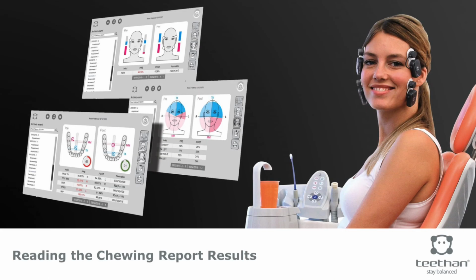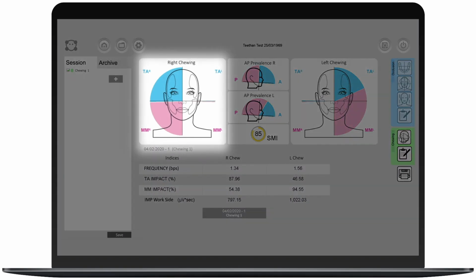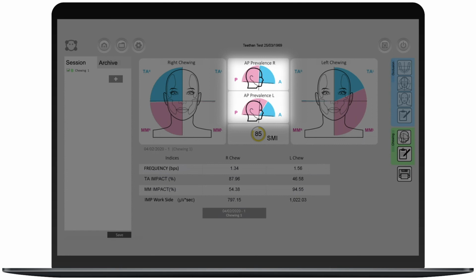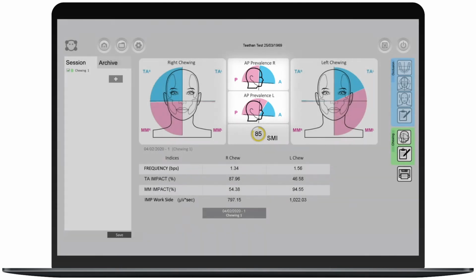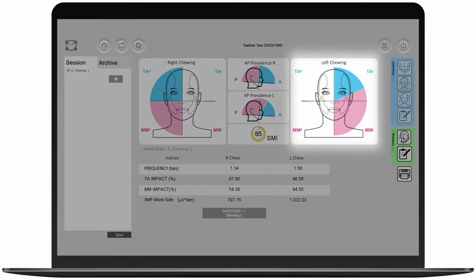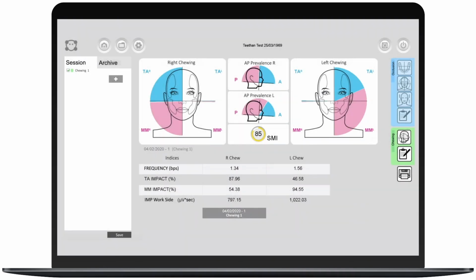Reading the chewing report results. Reading the report from left to right, we can see the chart related to the chewing test on the right side, the antero-posterior prevalence of the right and left side chewing in the sagittal plane, the global symmetry index, noted as SMI, and the chart relating to the chewing test on the left side. All of the graphs represent the neuromuscular coordination during the dynamic task.